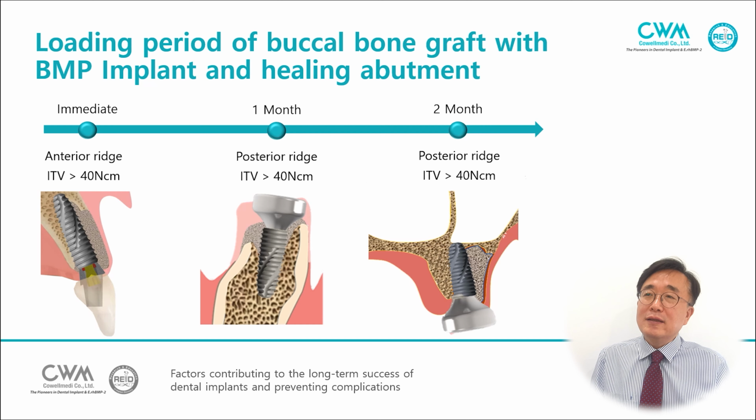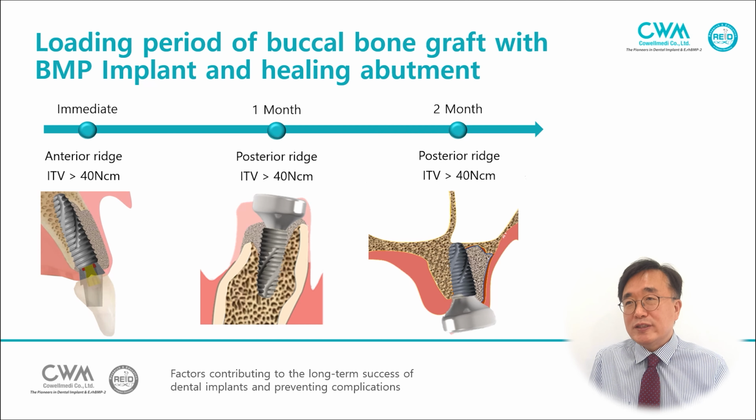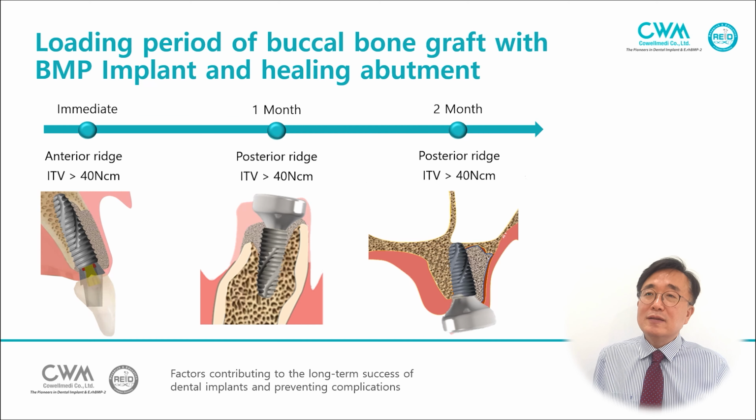In the anterior ridge of the upper and lower side, the implant is fixed with 40 Newton centimeter. We can connect immediate restoration and loading. In the posterior ridge of the mandible, the implant was fixed with 40 Newton centimeter.